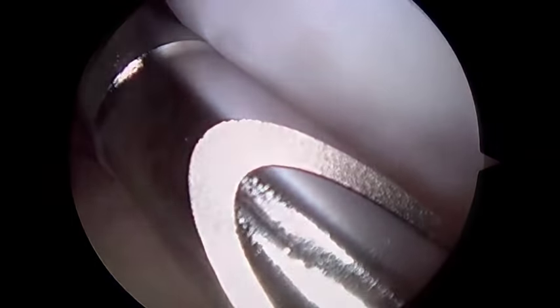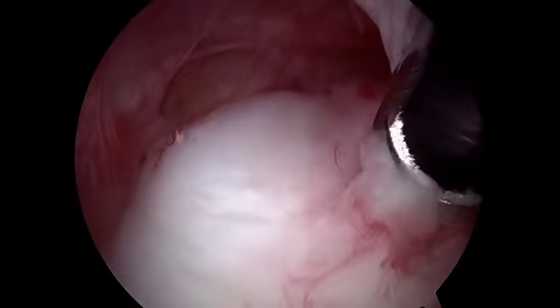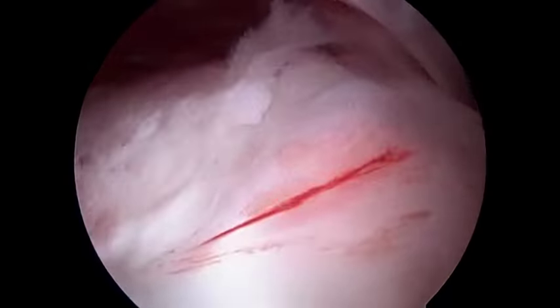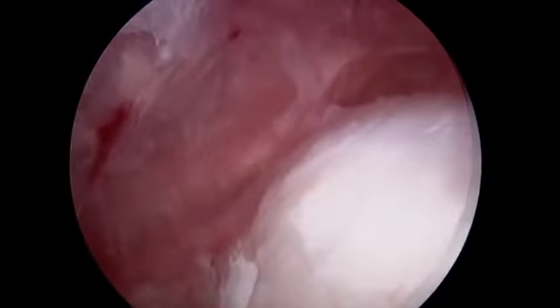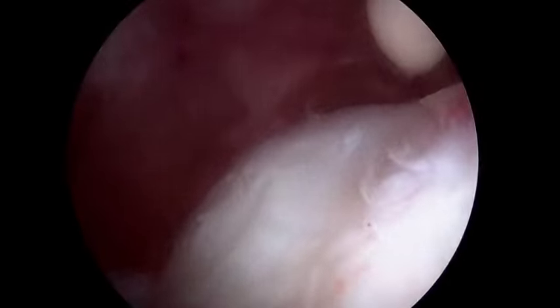So now we're going to go on the top side and take a look at the rotator cuff in the subacromial space. Okay, so now we're on the top side of the rotator cuff. And here's the superior part of the cuff. A lot of scar tissue from just the adhesions and previous surgery. And we're going to trim some of these adhesions and scar tissue out with this motorized shaver. So the rotator cuff is below us here with the white, and that looks pretty good.